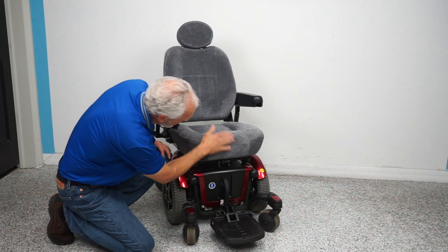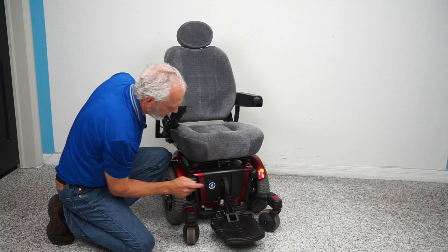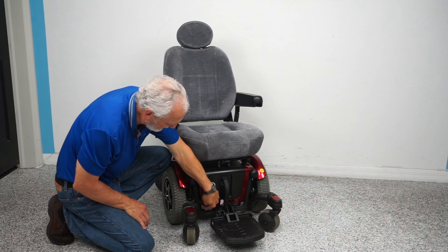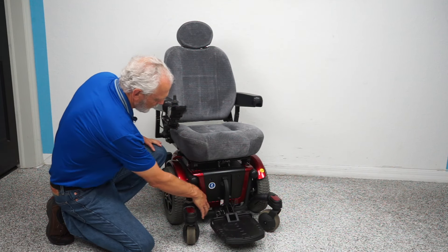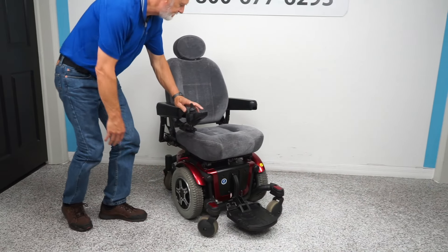So that's how you take the seat off or raise it, but you shouldn't have to take the seat off because the batteries come out from the front. Your reset button is right there — that's where your reset button is.